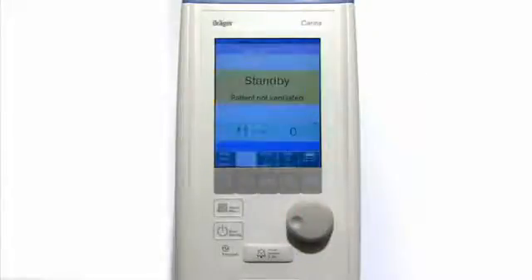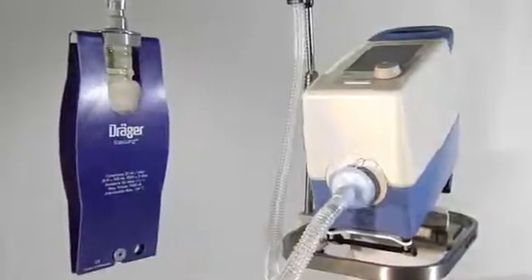You have now successfully completed the Carina system check. Carina is now ready to comfortably ventilate your patient.